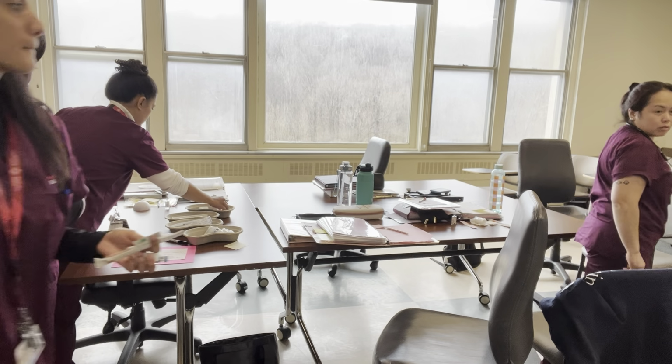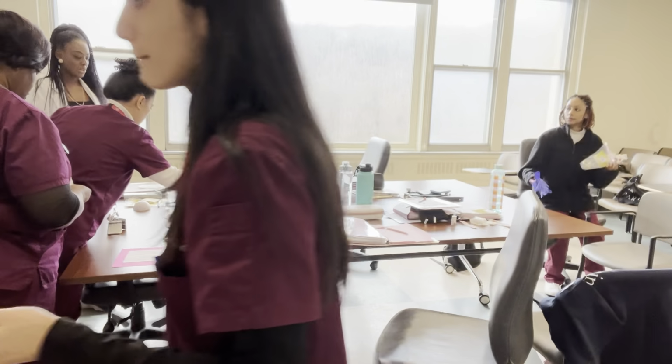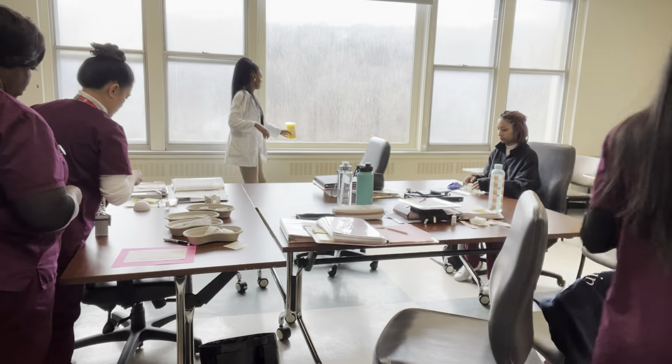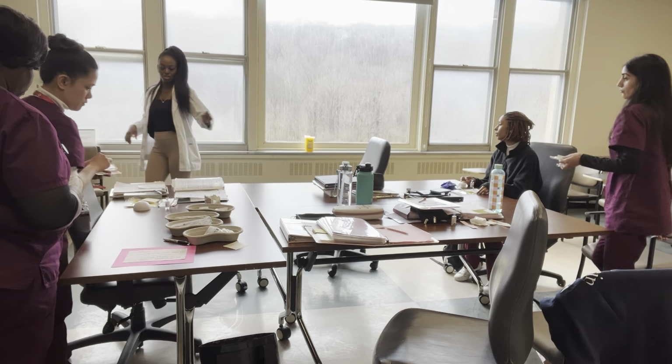If you have any questions during the process of your preparation, I will absolutely answer them. And we'll pretend like this is where the insulin goes.